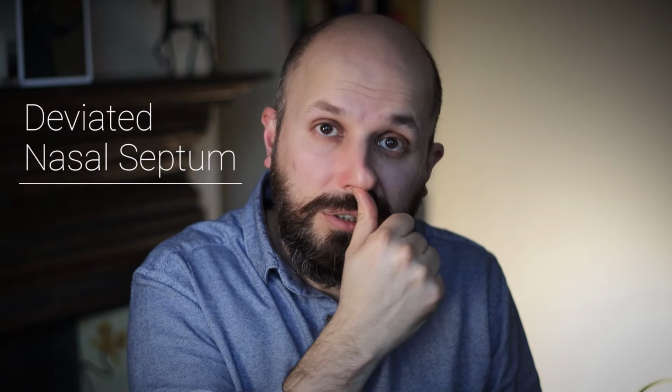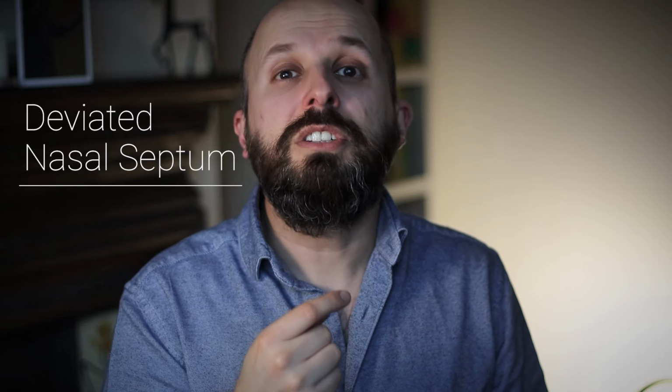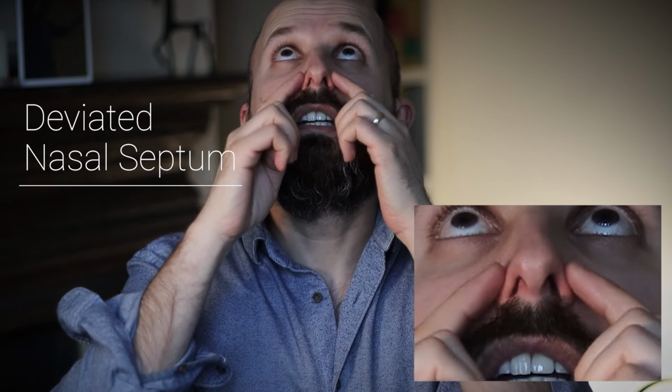And the idea is that those people who've got a twisted nose, or when you look up their nose, this part of your nose collapses in like that. In those situations where your nose keeps collapsing in or your nose is twisted, and what you're trying to do is improve the passage of air through your nose, these nasal dilators, and I've got a few here, there's this one, Better Sleep, and AirMAX. What I'm going to do is go through these devices and show you the pros and cons of each of them.